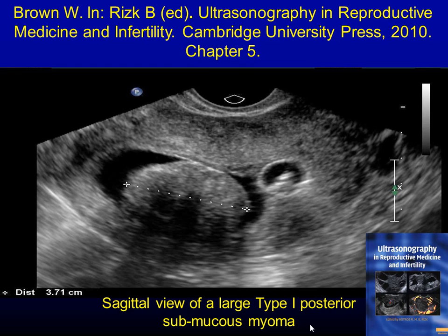So submucosal fibroid is classified into 3 degrees as far as inside. There is a type 0, basically a polyp hanging inside the uterus, which you can twist, you can do many things. There is a type 1, which is like this lady. That fibroid goes a bit into the wall. So when you resect it, you have to remove part of that wall. Type 2 is when this part that is in the wall is going almost beyond half the thickness of the wall. The thickness of the wall varies tremendously.